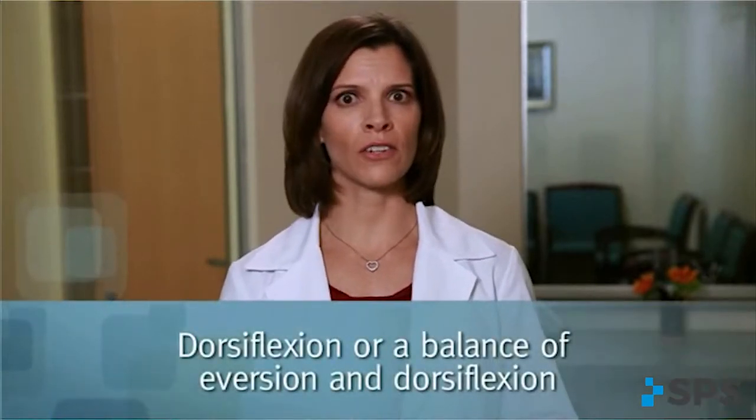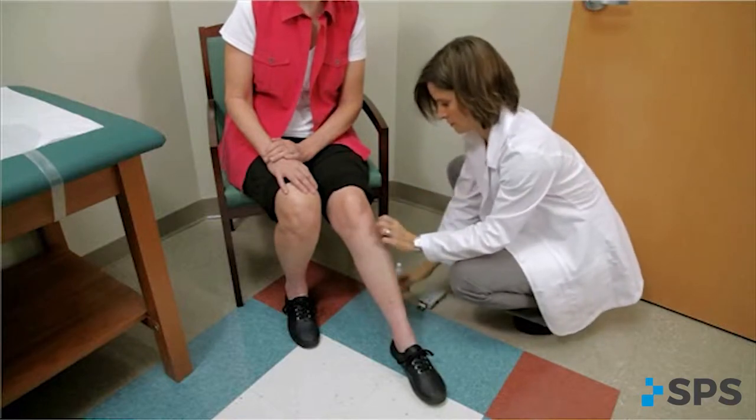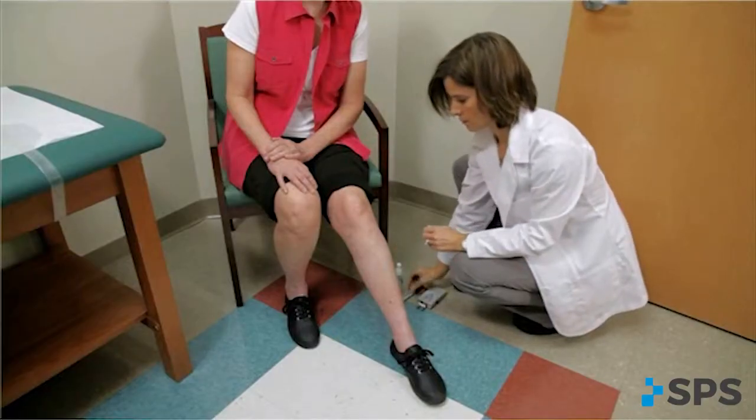Pure dorsiflexion isn't always achievable and may not be essential for toe clearance in all cases. A functional foot lift may be a balance of eversion and dorsiflexion. Very slight shifting of the mini stim along the nerve pathway will allow you to identify the spot that produces the optimal movement. When you find this sweet spot, mark the location of the posterior black base node on the leg. This is the starting point for the placement of the posterior electrode.